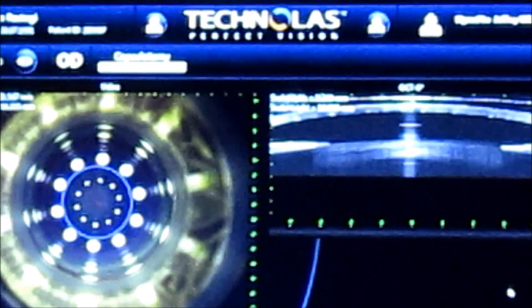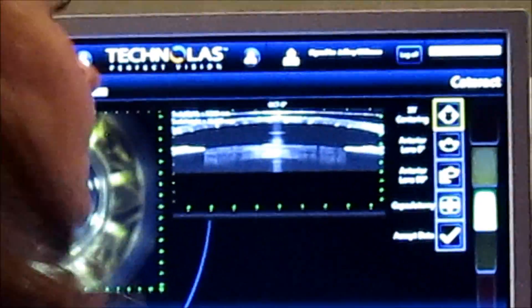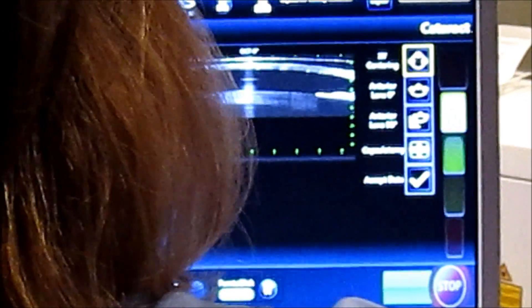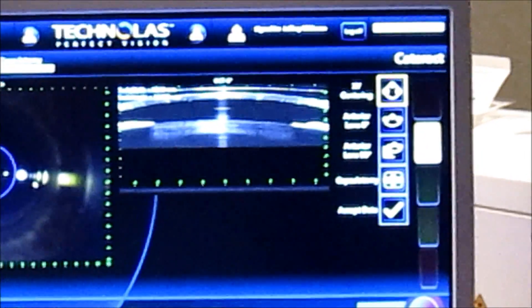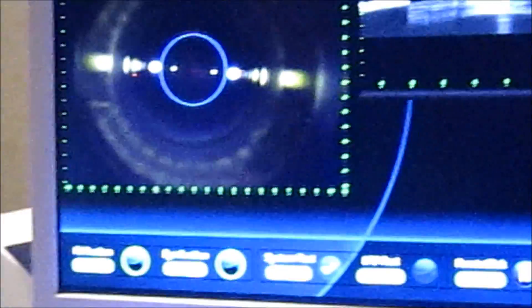We're looking for no folds in either the OCT image or the central image of the cornea. Once we have a green light — as you can see, flashing on the very right side of the screen — we have yellow and green. We try to keep it in the green, showing adequate vacuum.